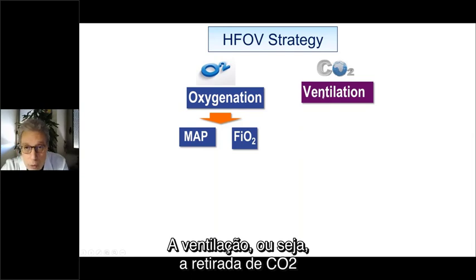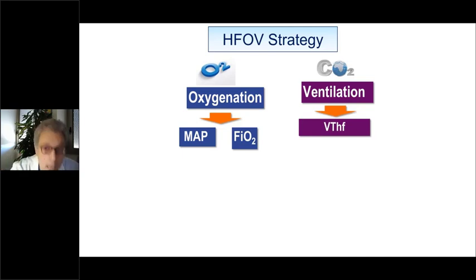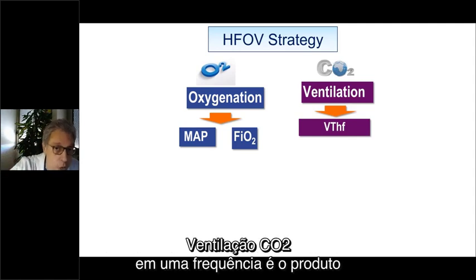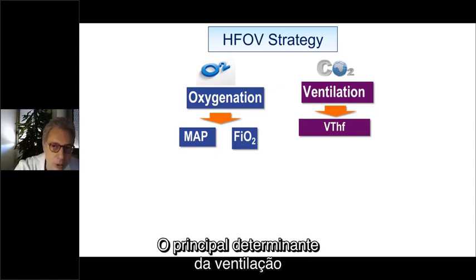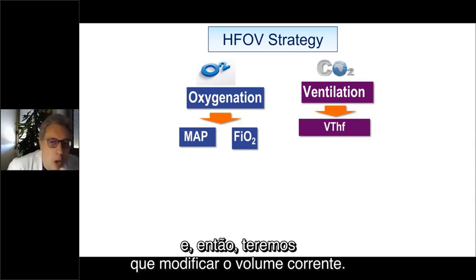The ventilation, that is the CO2 removal, depends on the tidal volume. Higher tidal volume, higher ventilation. Do you remember the equation? DCO2 in high frequency is the product of tidal volume squared times the frequency. So the main determinant of the ventilation will be the tidal volume.